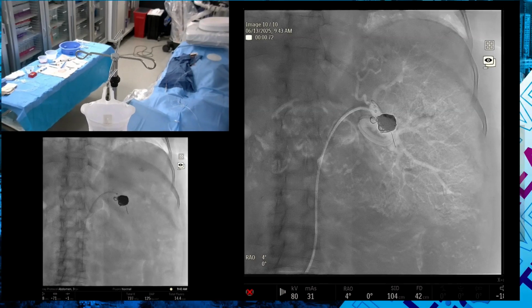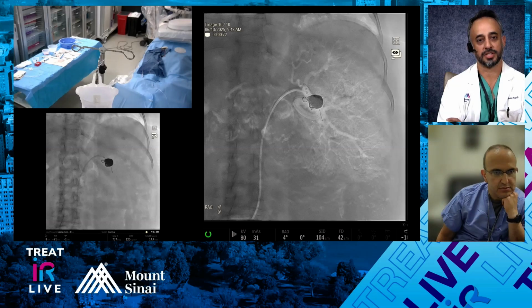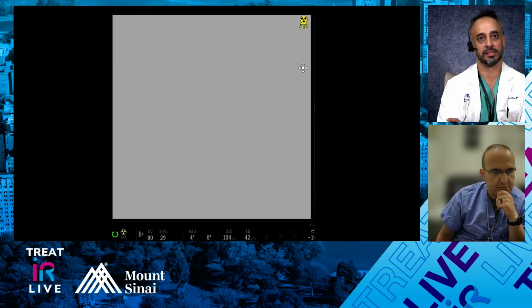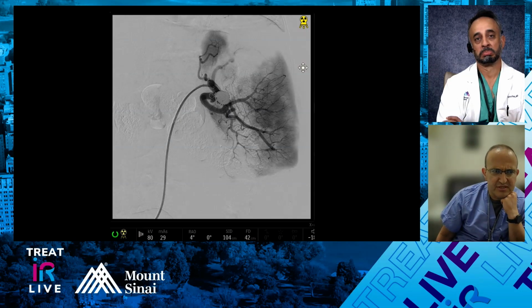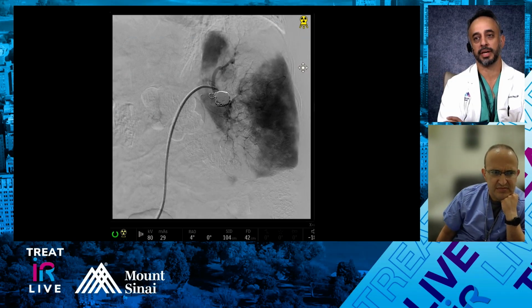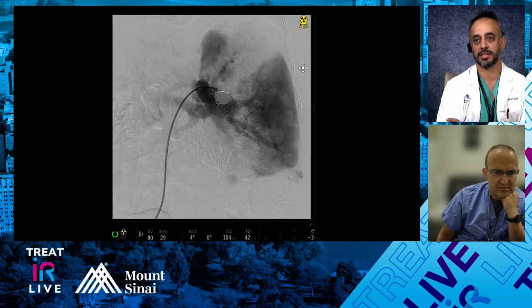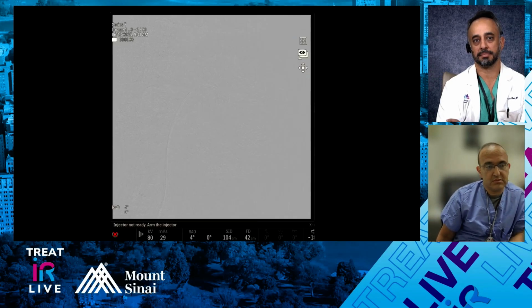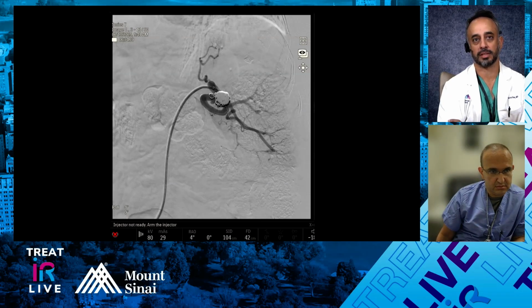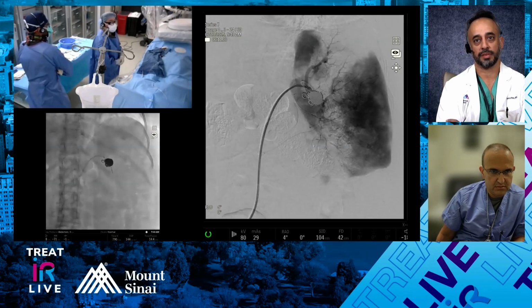So Ed, while you're stepping out to do the run, did you heparinize this patient during the case? Because you obviously have the sheath up around the celiac and splenic artery. No, we did not heparinize. We have a side flush for sure with heparinized saline, but we didn't give any heparin. Rose, do you usually heparinize your patients? No, it depends. When we do renal aneurysms, depending on how the setup is, like a case recently where we used a carotid stent as a stent assist, we heparinized just because we had such a big system across. We're not checking ACTs or anything, but at the beginning when we're putting out the stent, we heparinize a little bit so we don't get clot going distal. But typically, no. It's sort of a one-off.